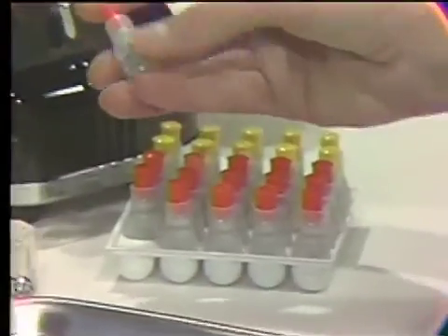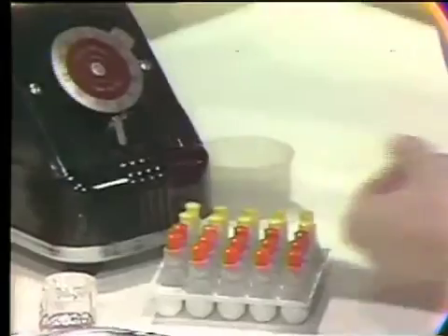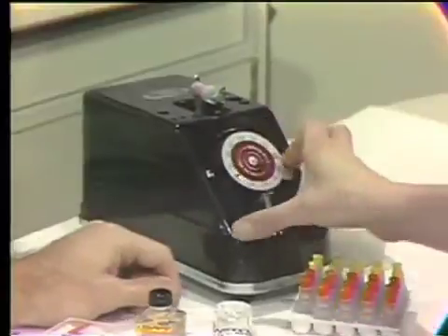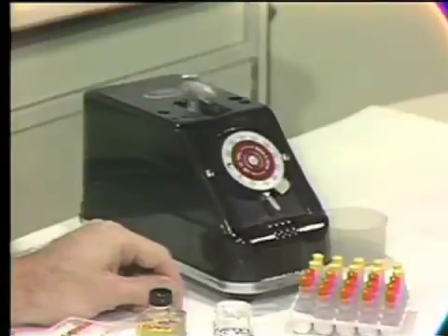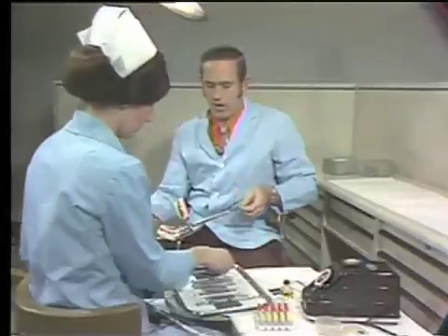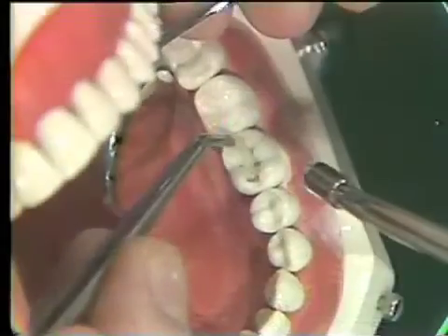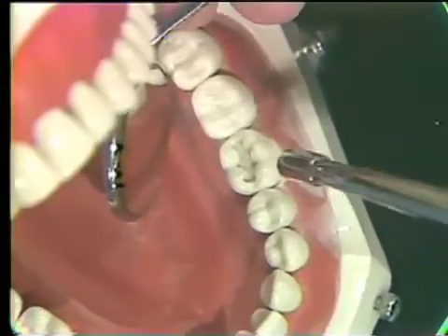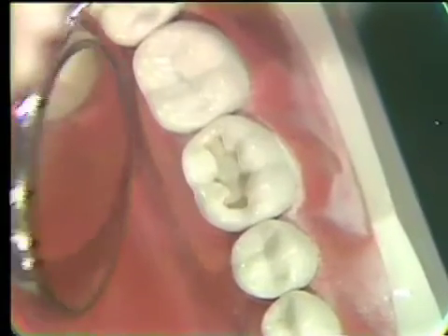Now let's take a look at our alloy. We're going to be using the Kerr Spheralloy, which is pre-packaged and pre-measured. Just by pushing the top down and hitting the button, we can set it into the amalgamator and start it mixing. While we're mixing the amalgam, it's a good time to apply our cavity varnish — in this instance, our Copalite. We'll just gently dab it onto the tooth and dry it a bit. That's about all there is to that portion. Now we're ready for our amalgam.